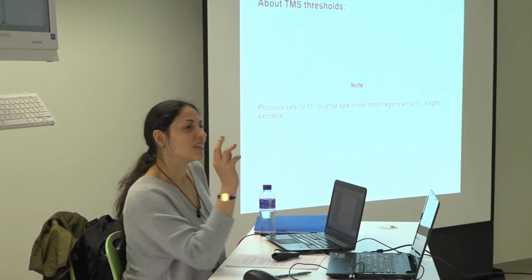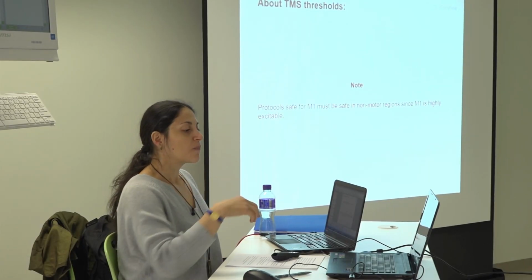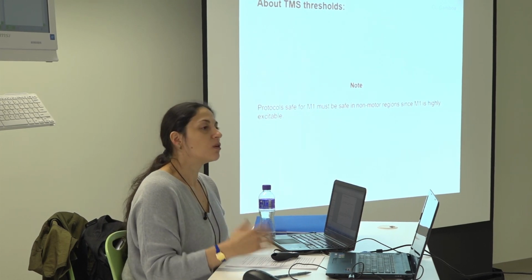So this is a note which I thought was important to write. A protocol safe for M1 must be safe in non-motor regions because M1 is highly excitable. So if I'm applying a protocol over M1, and it is safe for M1, it will be safe for other regions. It should not be different, is the conclusion they have reached.